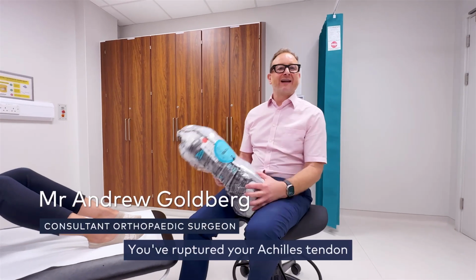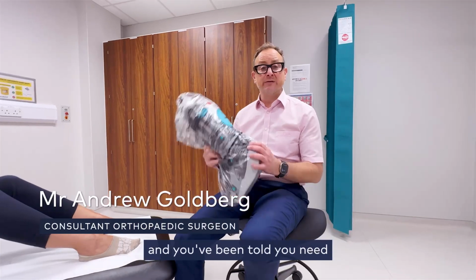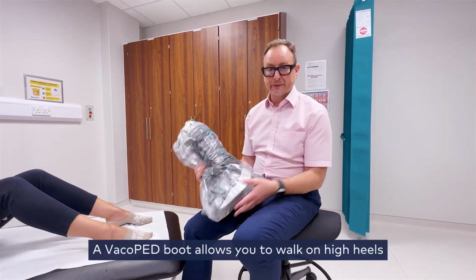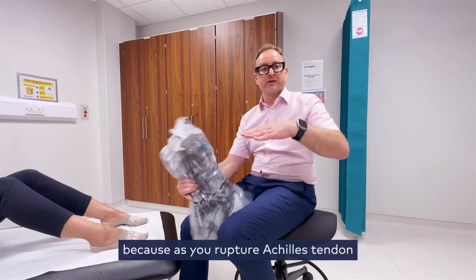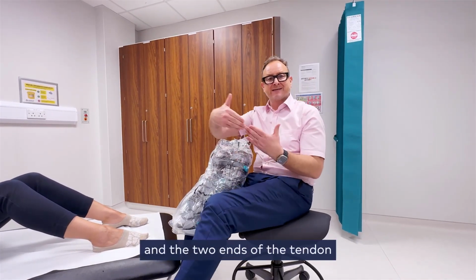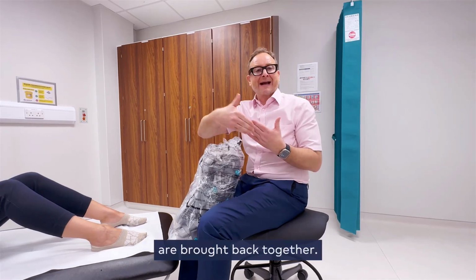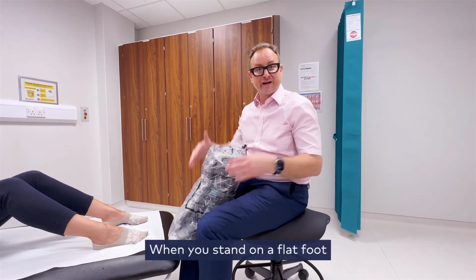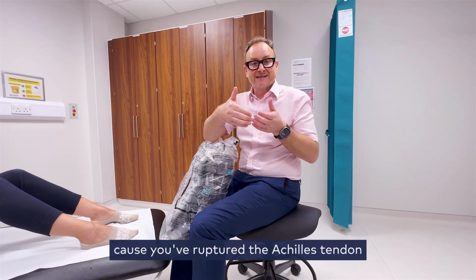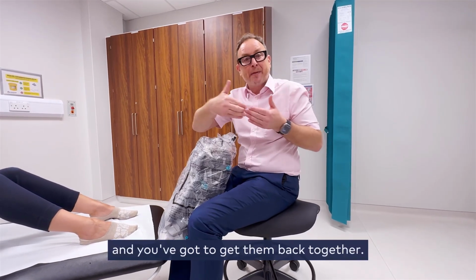You've ruptured your Achilles tendon and you've been told you need a VacoPED boot. A VacoPED boot allows you to walk on high heels because as you rupture your Achilles tendon, you want to be on a high heel so the two ends of the tendon are brought back together. When you stand on a flat foot, the two ends pull apart because you've ruptured the tendon, and you've got to get them back together.